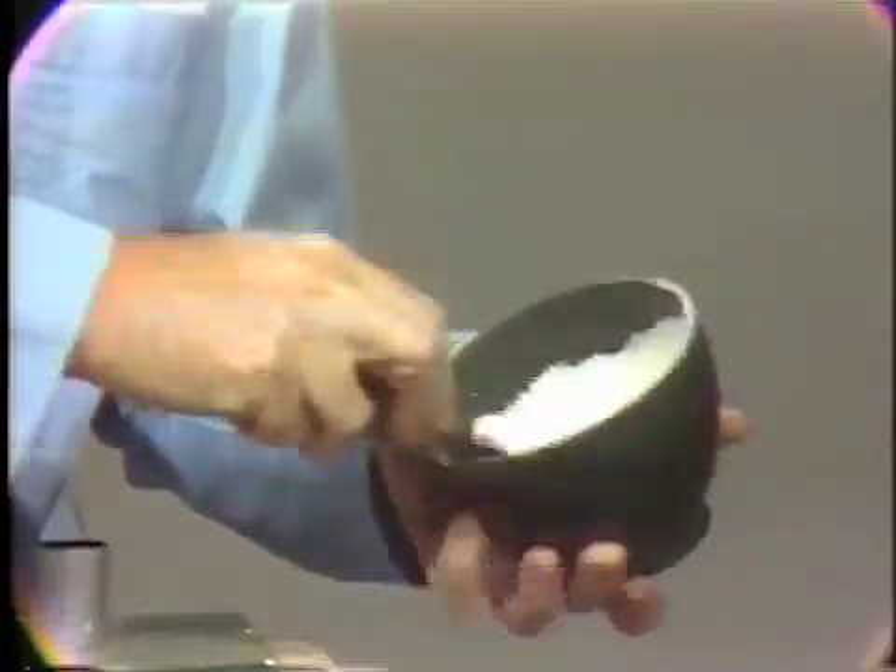We do not beat the material like you would beat an egg. We simply strop it against the side of the bowl. This minimizes the incorporation of air during the mixing of the material and still gives us thorough mixing of the powder and liquid.